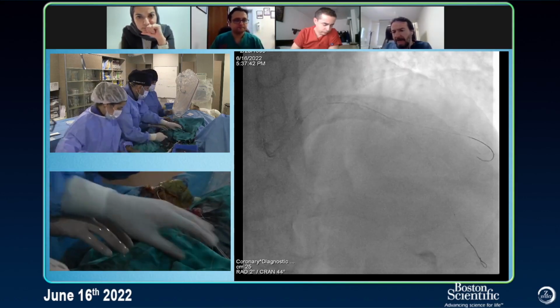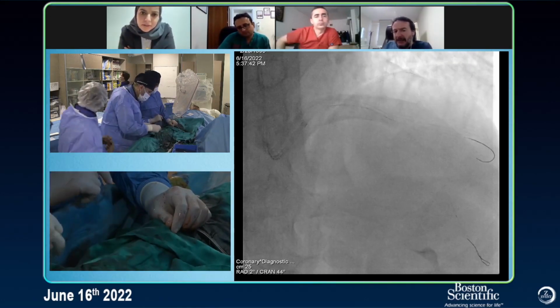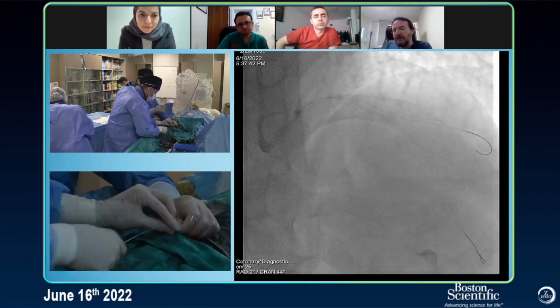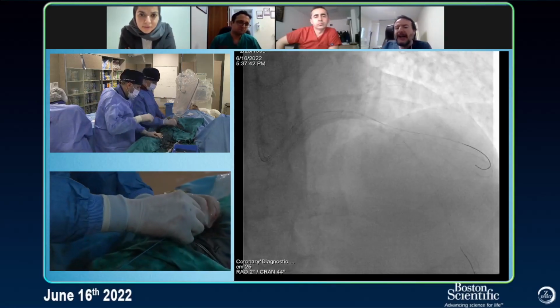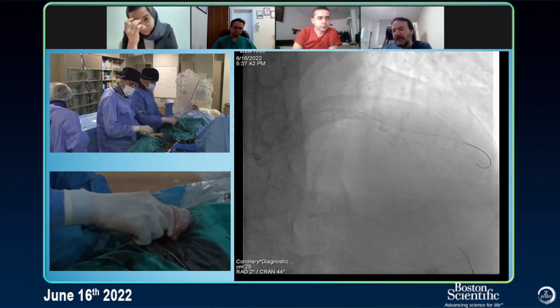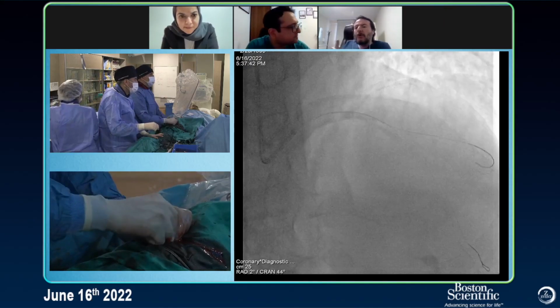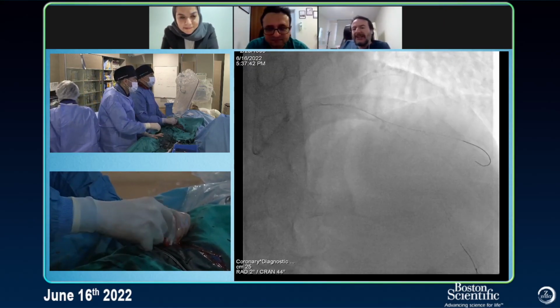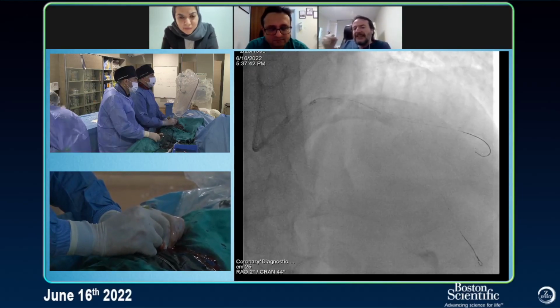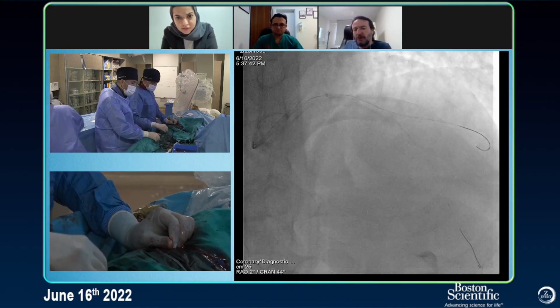It's safer. Because if you cannot go with the guideliner in, you may need again some kind of modification with the ballooning. We should do it beforehand, before introducing the guideliner at that calcified, dissected lesion. Because if you even go giving contrast from the guideliner, the pressure of the contrast is high with the guideliner, so you might increase the dissection. You see what I mean?